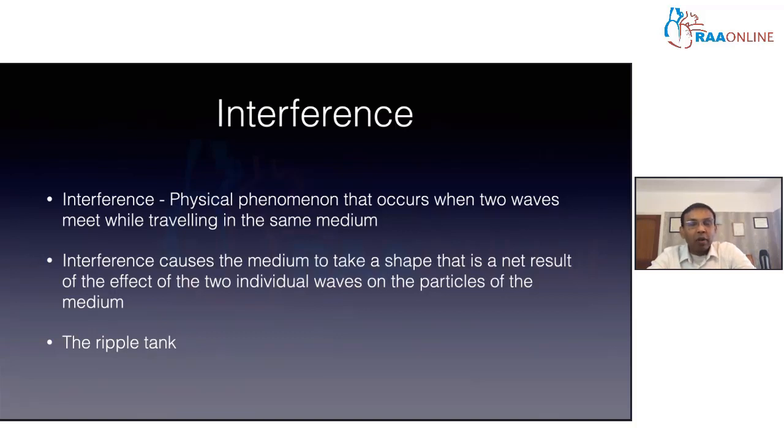The common example that we all talk about for interference is when we have jumped into a swimming pool or onto a puddle of water, or stood in a swimming pool trying to create waves. If two people create waveforms, the waves clash against each other, depending on whether the waves are in phase, as in the peaks of one wave meeting the peaks of the other, causing constructive interference, or a peak meeting a trough, causing destructive interference. That's what determines the interference pattern that you see.